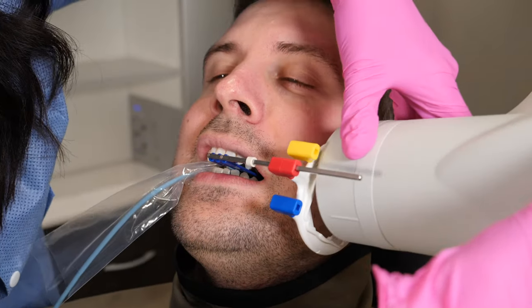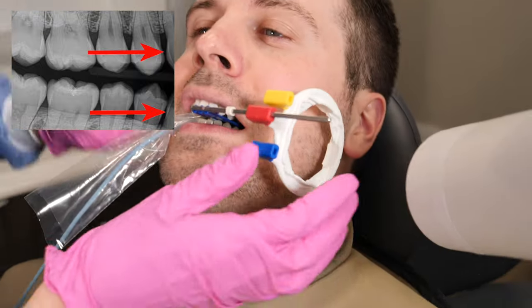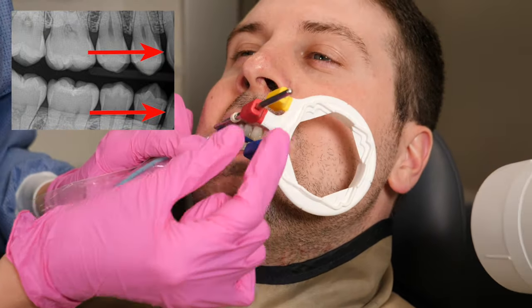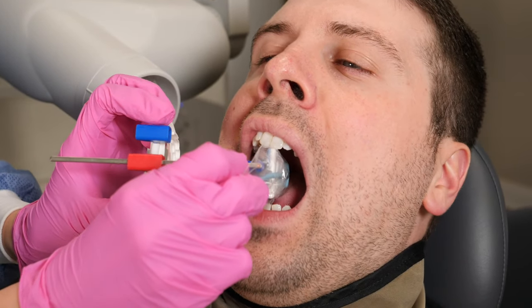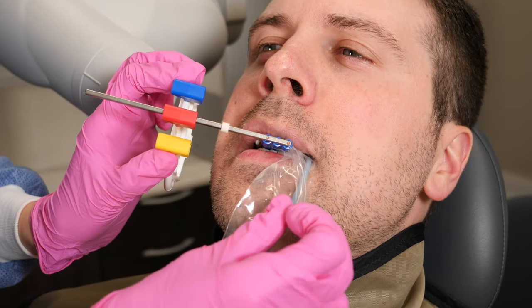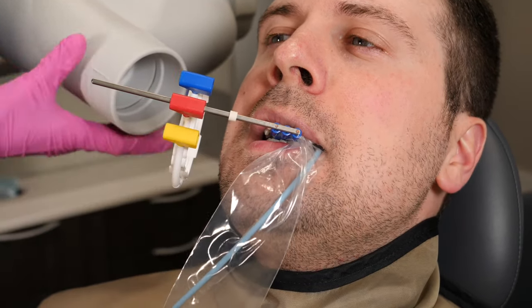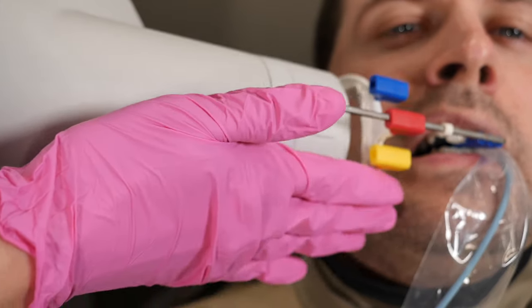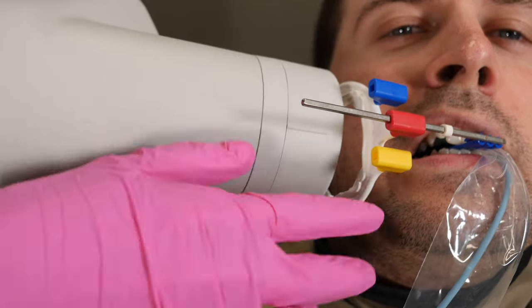Now for bite wings, try to get the distal of the canine in your premolar shot. With digital sensors, sometimes you have to angle the sensor dramatically, so the front of the sensor is basically touching the canine on the other side of the mouth. Remember to line up the tube with the teeth, not with the ring — not with the circle. With my x-ray unit, that's what works for me.